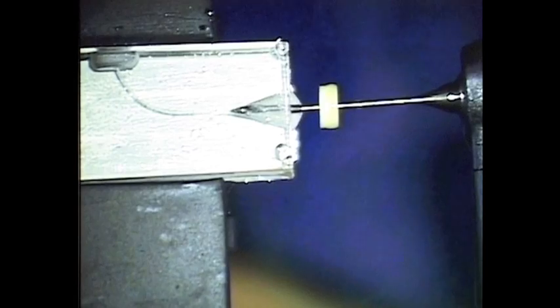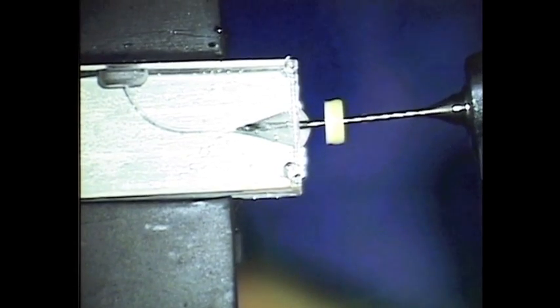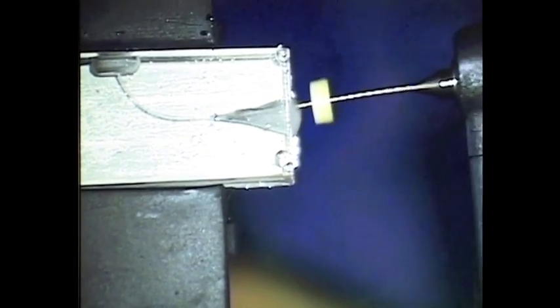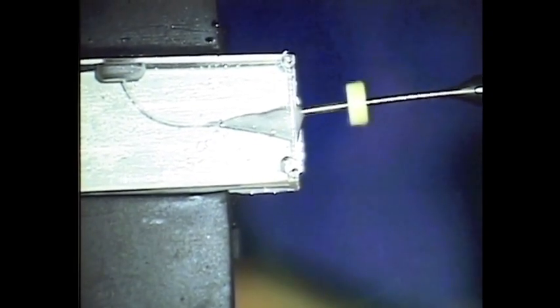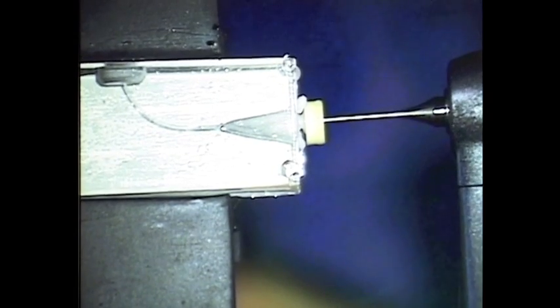Place this into the canal — I'm saying approximately 2 millimetres; to be on the cautious side you could say 1.5 millimetres, but you have to be mindful that the stopper can move. So you can see I'm just doing it on the outstroke, brush strokes, circumferentially. If you're doing it in a molar you must be careful of the furcation. I'm going to take that out now to double check that my stopper hasn't moved.